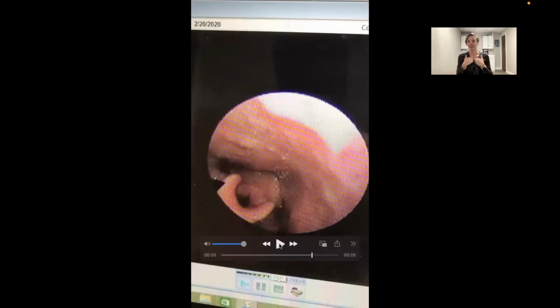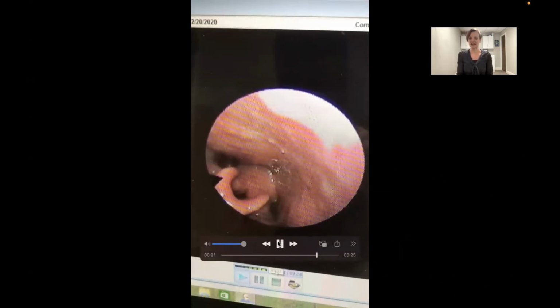Now, for me, the inside of the pharynx in terms of edema actually looks fantastic because I can see my laryngeal vestibule, I can see my structures, I can see my vocal cords. Also, my posterior pharyngeal wall, you can see, isn't screaming at me, so my epiglottis does have some room, some movement. And so what I'm looking for here is when my patient swallows, is it functional? The answer is yes, absolutely. So let's watch and see.